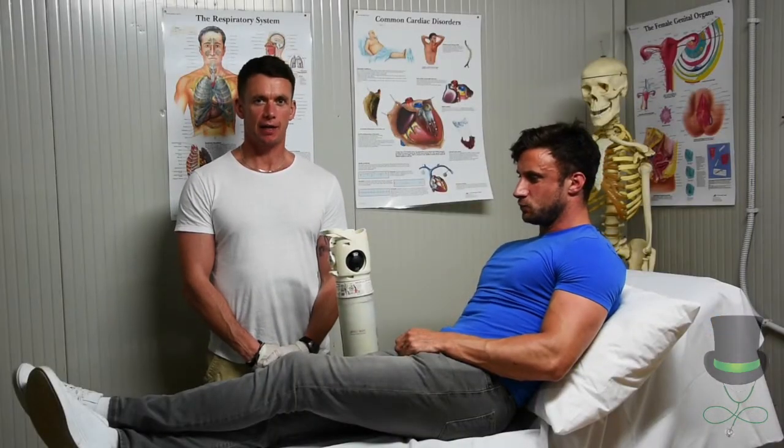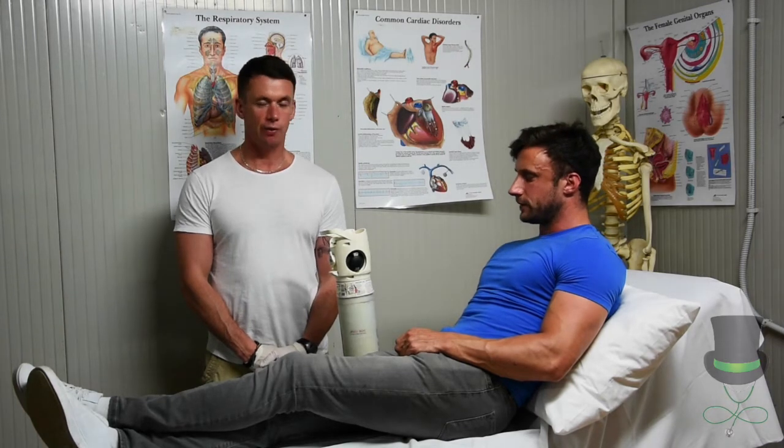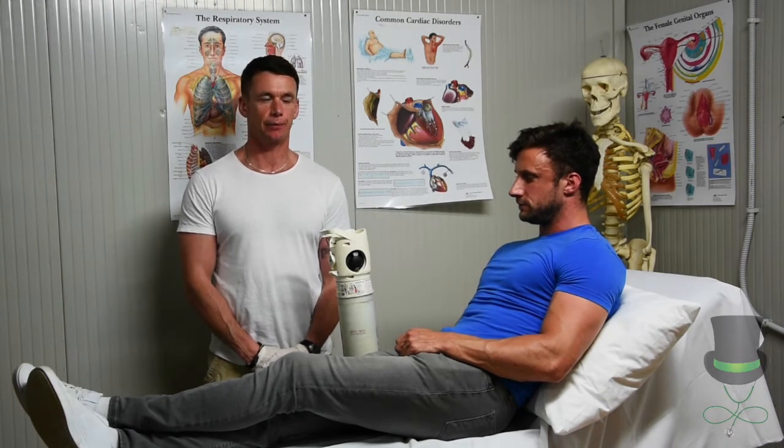Hi, my name is Anthony and I'm a paramedic. Today I'm going to demonstrate to you how to apply a non-rebreather mask to a patient.